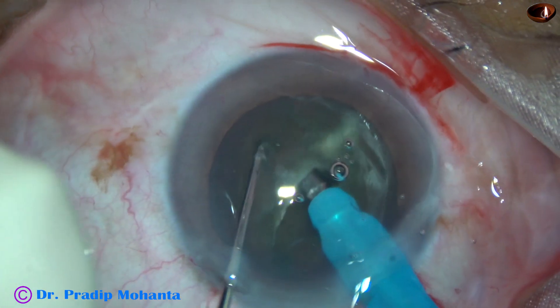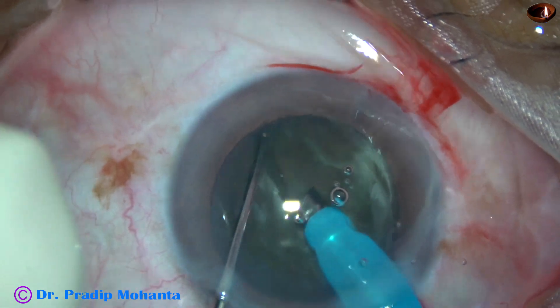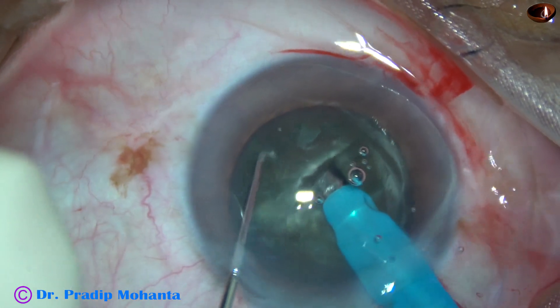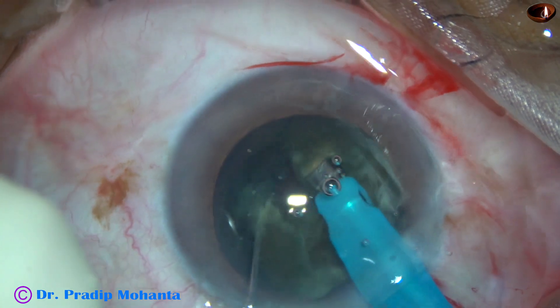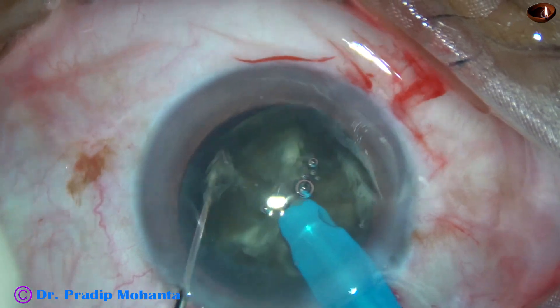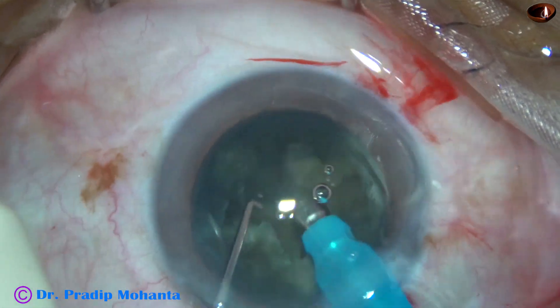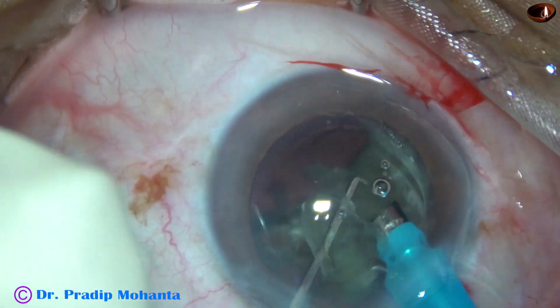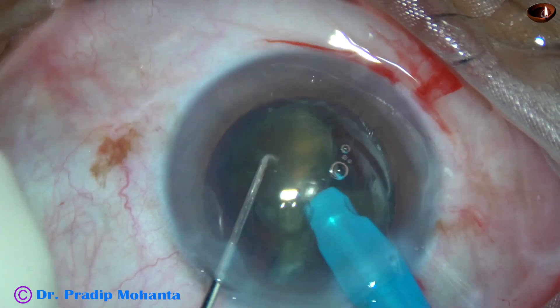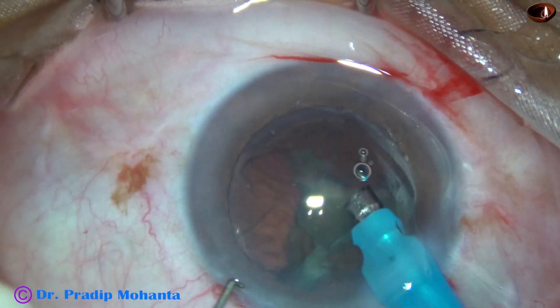This is a routine case. Everything is fine. The nucleus is about grade 4, and the nucleus is being divided into several fragments. This is the other heminucleus. It is also divided into two large fragments, and emulsification is started. The lens is a little leathery, and anterior chamber stability appears a little less. So I asked for lower vacuum. I started with 450 vacuum and reduced it to about 400 vacuum, and everything appears fine now.